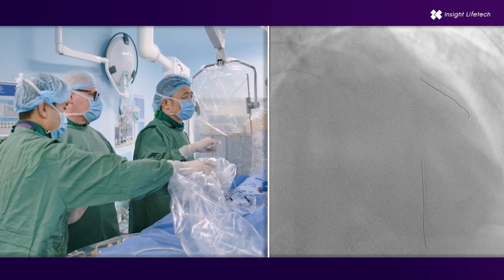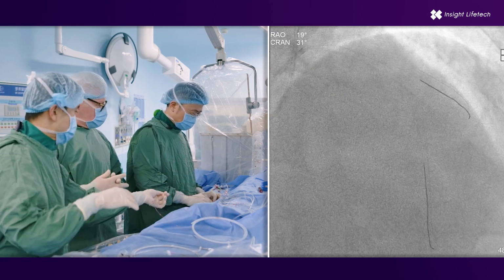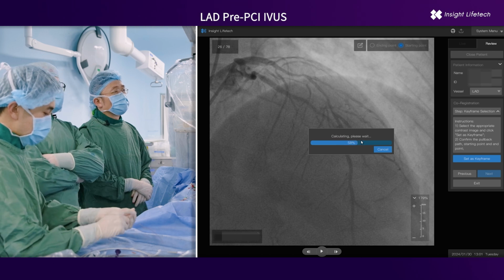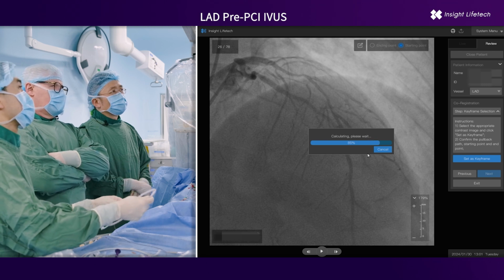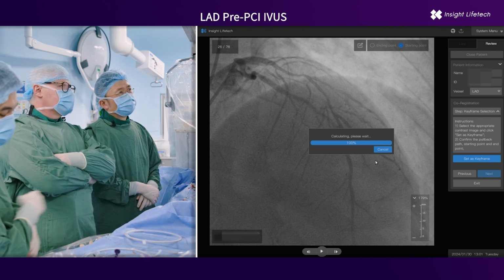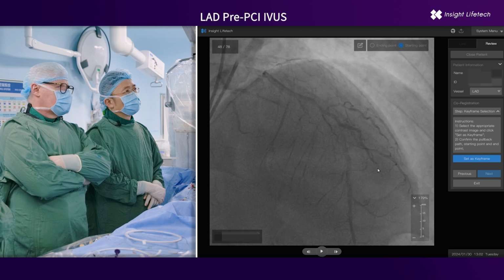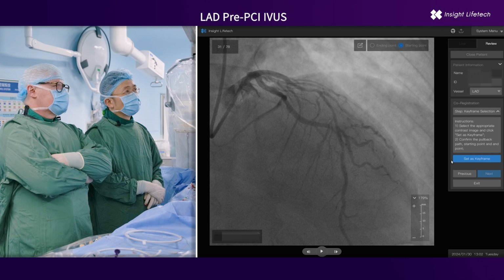Now we can withdraw the catheter from the artery, not to limit the flow too long. And now we can assess and measure. There are two additional features of this technology which are really good. First, we have online co-registration available, which takes like 1 minute to do, which is not so bad. And at the same time we have automatic quantitative assessment of the vessel, which comes with this device.